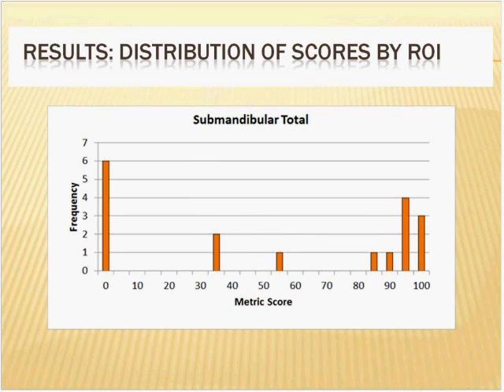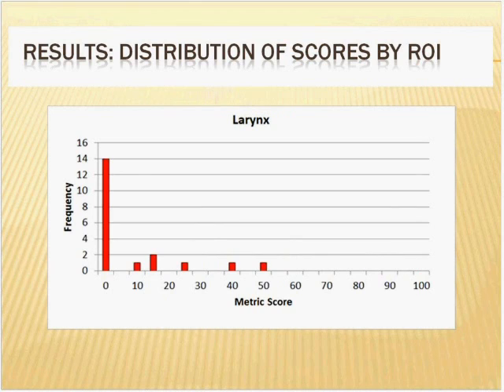Now notice when there's a clump somewhere, it may just mean there's a systematic difference in training. It may not be that someone can't draw. It may be that they were trained to do a different type of volume here. And so I think consistency in training is obviously one of the things that should fall out of these quality initiatives, and then we should always be training to the right answer, of course.